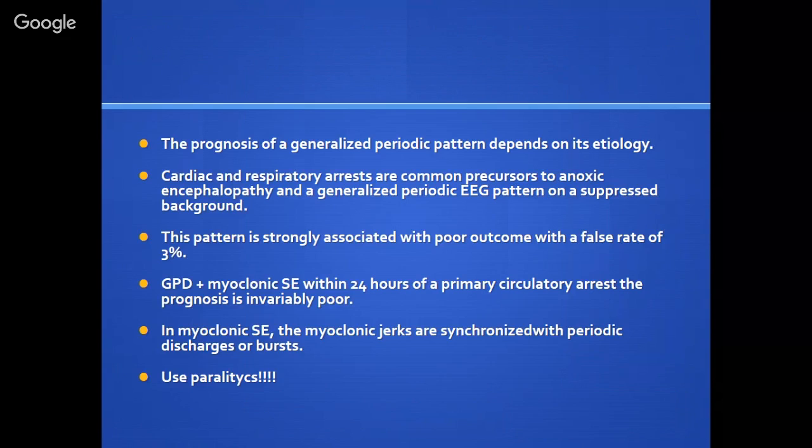The prognosis of generalized periodic patterns depends on etiology. Cardiac and respiratory arrest are common precursors to anoxic encephalopathy.